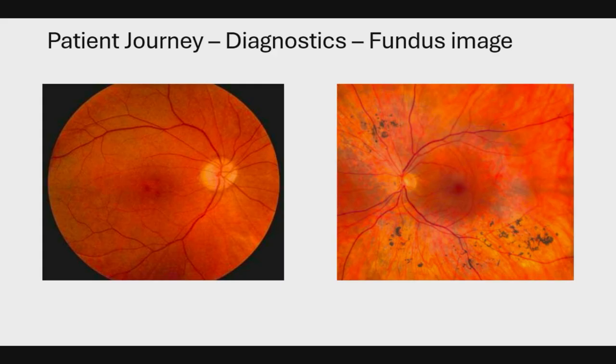And also what you see on the right picture more clearly are these bone-like pigment clumps in the mid-periphery. So that is fairly clear. So you would tell the patient, okay, this is retinitis pigmentosa. And so what could electrophysiological examination then help in addition?